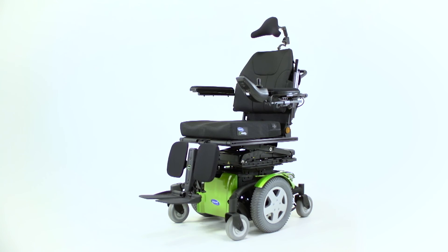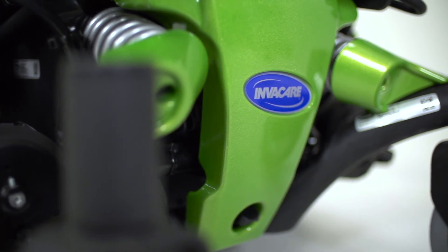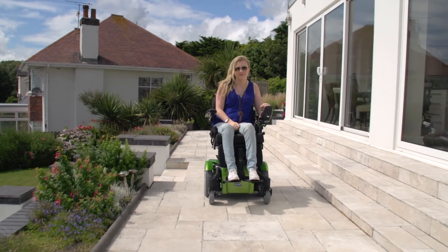The Ultra Lomax seating system has been designed to be the new benchmark in the complex rehab power positioning arena, and will revolutionise how you sit with its outstanding manoeuvrability.